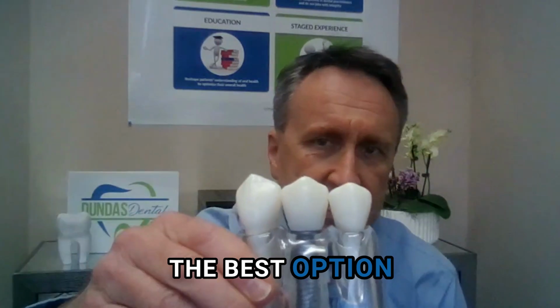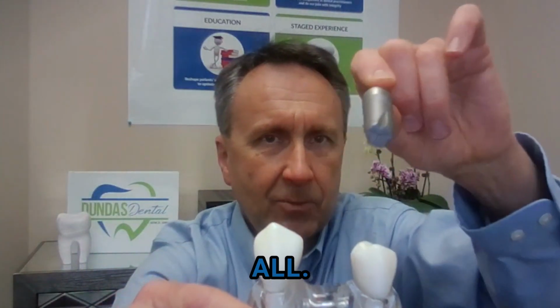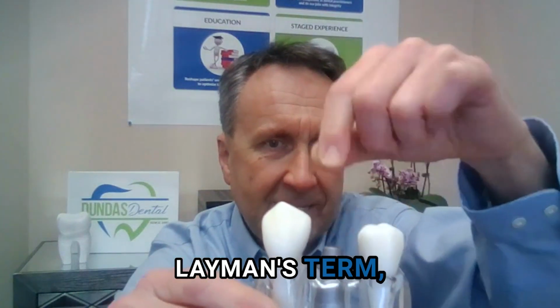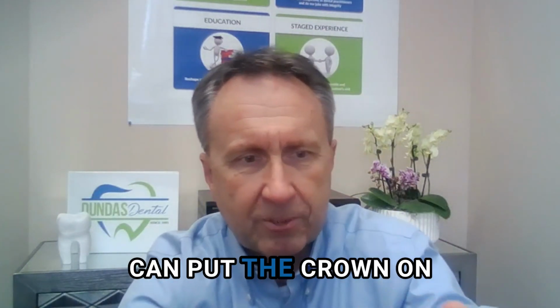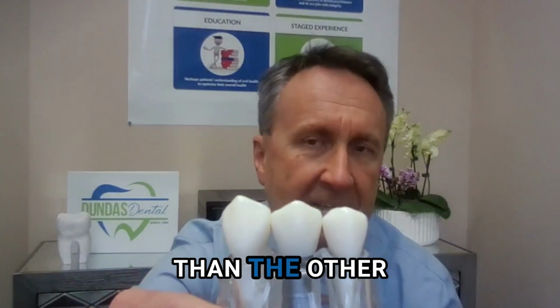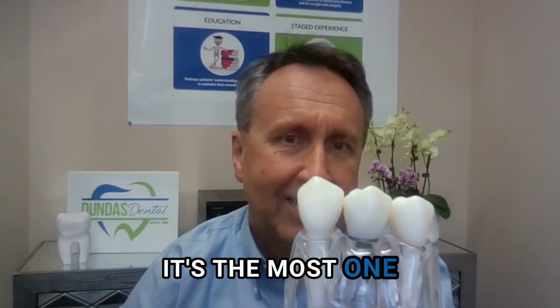The best option is to do an implant. What do we do there? If the tooth is missing, we do not involve the neighboring teeth at all. We place this fixture, as we call it, or implant, in a layman's term, and that replaces the root. And then the implant has this little part, which is used so that we can put the crown on it. And that's the tooth replacement. So that's the implant option. Implants are a little bit more expensive than the other options. However, as far as the health is concerned, the natural looks and the function, it's the one most like a natural tooth.